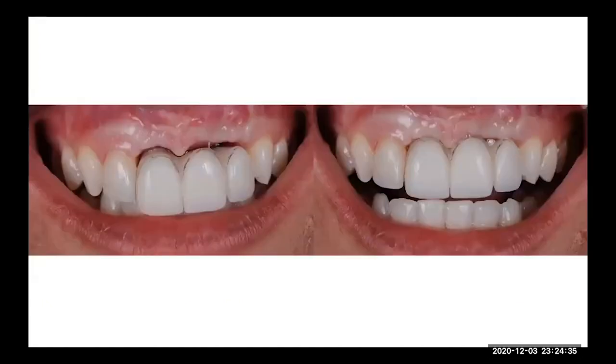So these cases are special. Like I said before, I work with 3 prosthodontists next to me. So for the big cases and the important cases, normally I'm available to start the case in the morning and finish the case in the afternoon, no matter what. So this is our try-in. Before, we normally use press technology, so we wax everything before press.